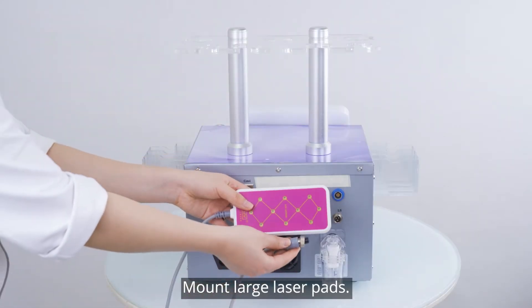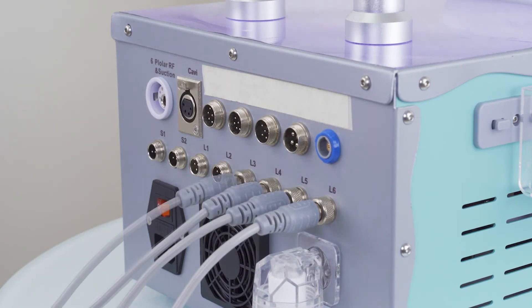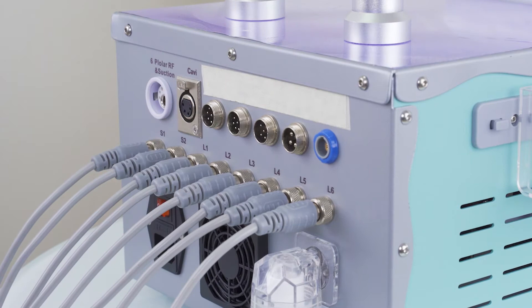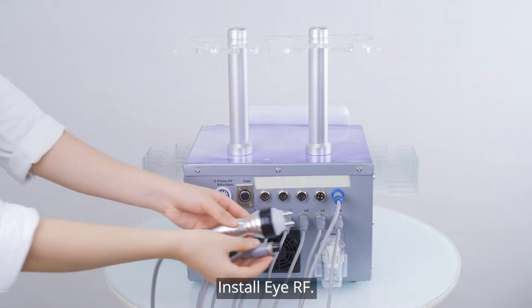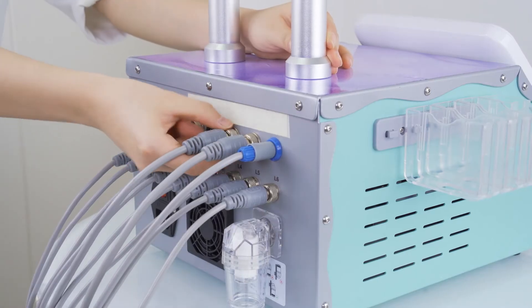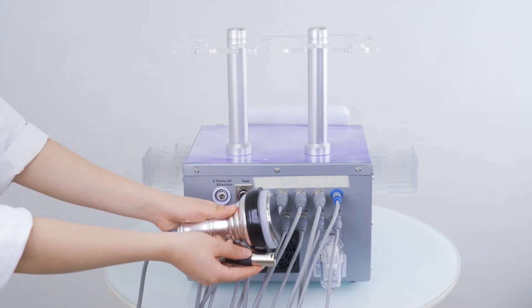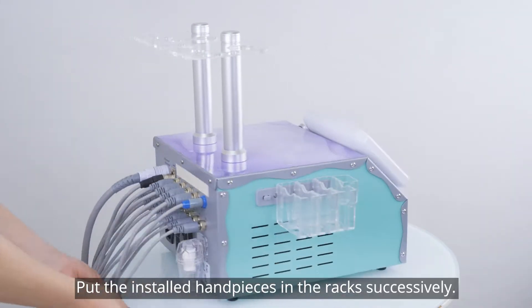Mount large laser pads. Install small laser pads. Install IRF. Install Face RF. Install Body RF. Fix hot and cold hammer. Install 40K cavitation. Install vacuum and RF. Put the installed handpieces in the rack successively.